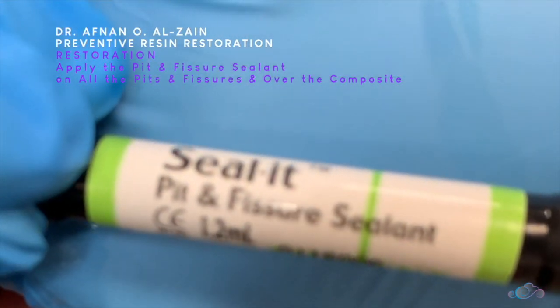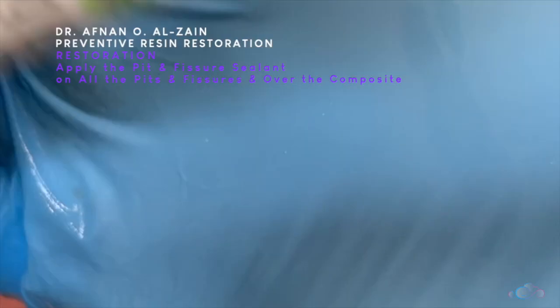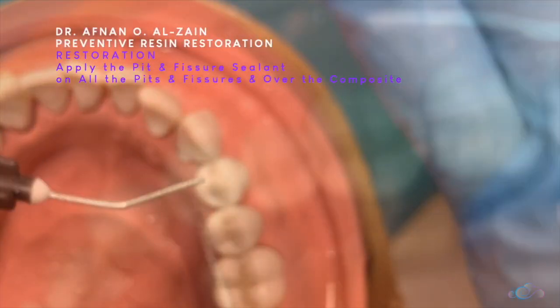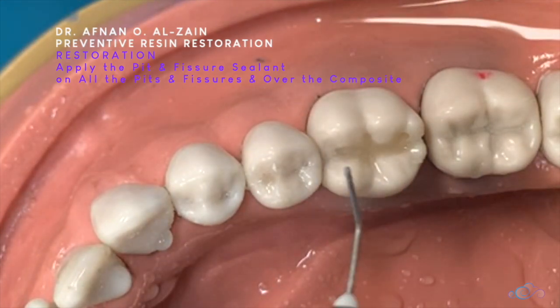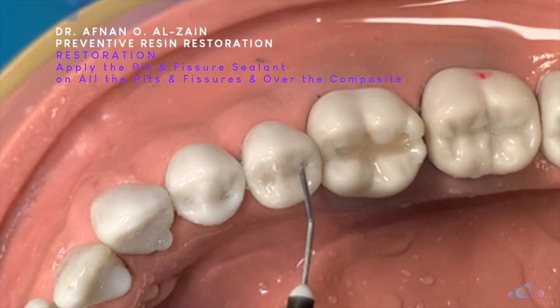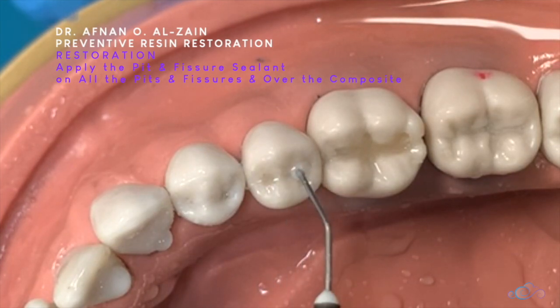After that, we're going to apply the fissure sealant all over the rest of the grooves. With the nozzle, we just apply a little bit. You can see the fissure sealant has different colors — you can paint it or use the same color. I apply it on the groove.